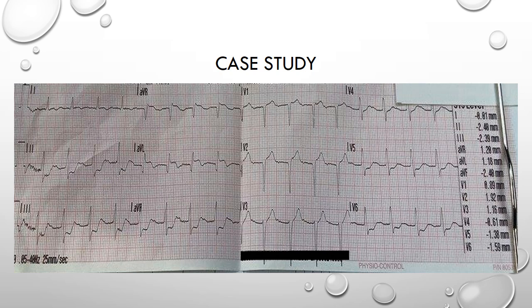We know that ischemia doesn't localize, so it could be reciprocal to ST elevation elsewhere. But if we check for at least two contiguous leads with ST elevation so that we can call a STEMI, we don't really find that here. The anterior leads have some elevation in them but we don't quite meet the criteria for calling a STEMI yet. We also have ST elevation in AVL, but when we look at lead 1 it is showing ST depression according to the computer and is at best isoelectric, so we can't call this a high lateral STEMI either.